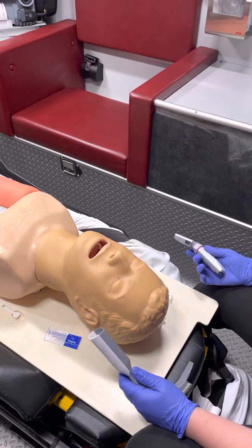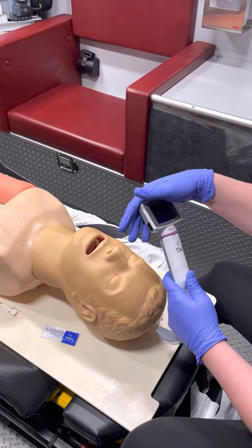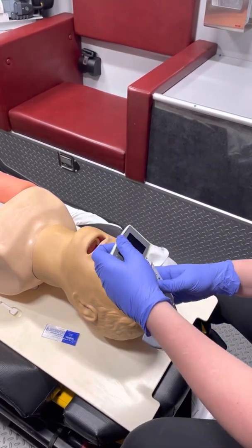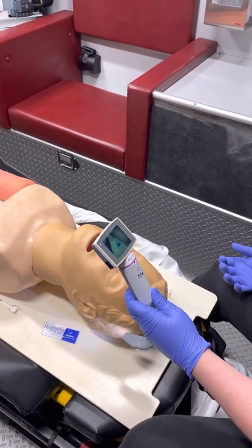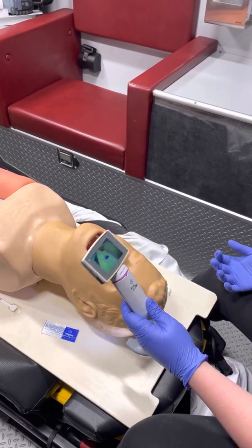One thing I want to say up front: when you're putting the King Vision together, make sure you pop the blade into the camera unit before you turn it on. Sometimes if you turn the camera unit on before putting the blade in, you'll get a white screen and it won't work. So I find it best to make sure you're doing it in order.